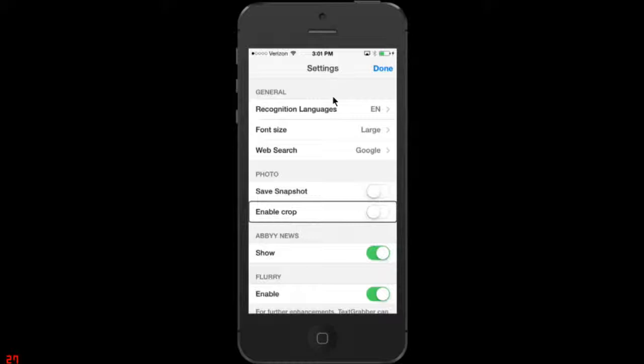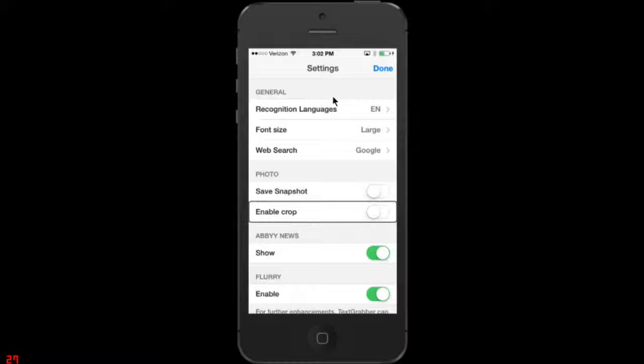Tap to toggle settings. I also disable this. This is enabled by default. And so, what happens is, when you double tap on the viewfinder to take a picture, it will give you this extra step before doing the OCR so you can kind of adjust the borders of, maybe there's a little chunk of the page that you don't want it to capture that got, when you took the picture. If you have some vision and are able to do that, it may be a thing that you want to play with a little bit, but I just, for the sake of speed and efficiency, I just turn that off so that when I double tap, boom, it takes the picture and it jumps you right into the OCR mode. And like I said, within about five seconds, you're reading the text.